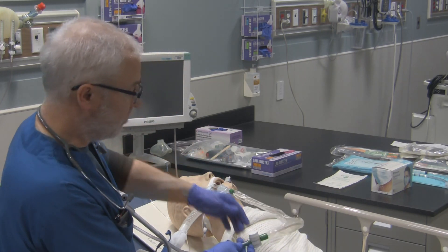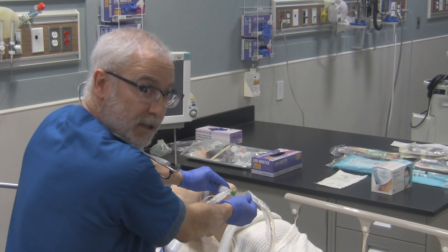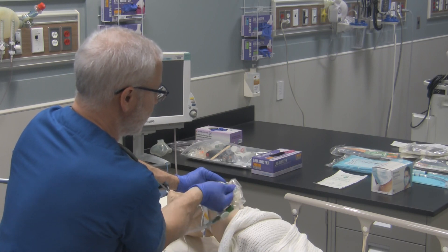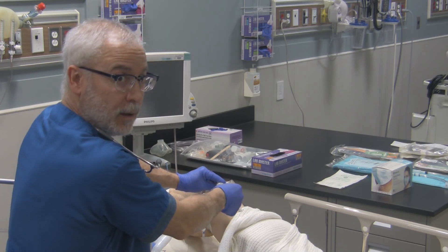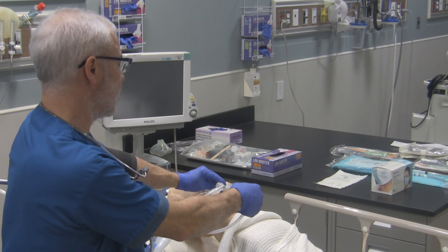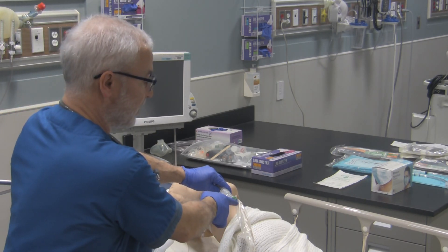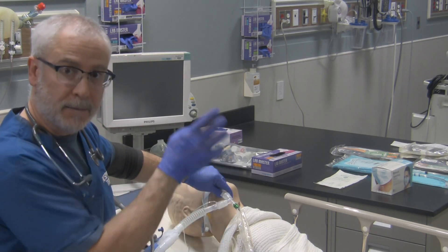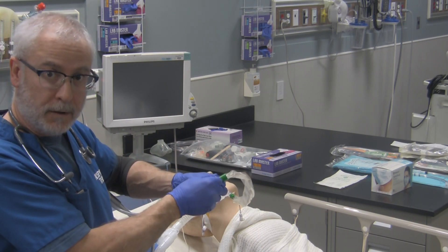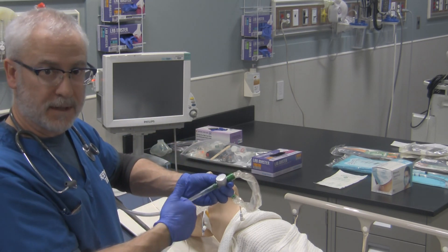Stabilize the tube. Make sure the safety is unlocked so you'll have suction. Support the tube, then grab the catheter and sheath at the same time. Advance the catheter while pulling back on the sheath, continuing this motion until you feel resistance or the catheter stops. Pull back one centimeter, then apply suction and withdraw secretions from the patient's airway until the black line on the suction catheter is visible outside the ETT, indicating the catheter is completely withdrawn. At this point you can lock out the catheter from the suction source if you don't expect to suction again soon.